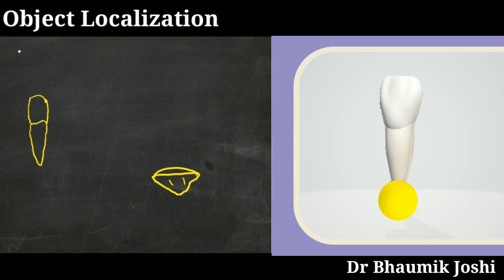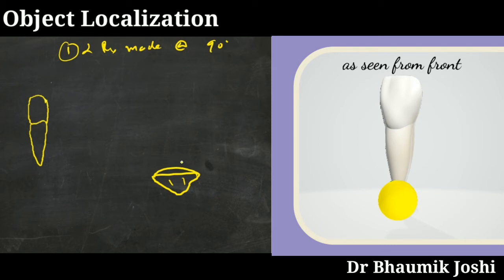These methods are mostly useful in cases of the mandible. So in the case of a mandibular tooth, when you want to see the presence of an object periapical to a tooth, we can take two radiographs. First we can take an IOPA. As you can see in this image, from the front the object will appear to us in the periapical region. But in the IOPA, we cannot tell based on this whether the object is present buccally or lingually.